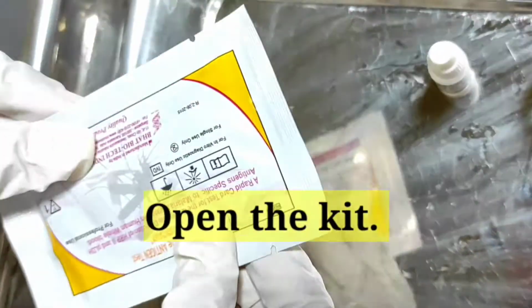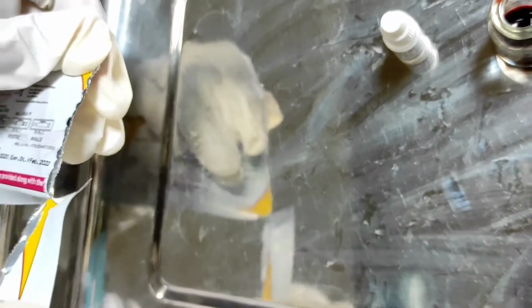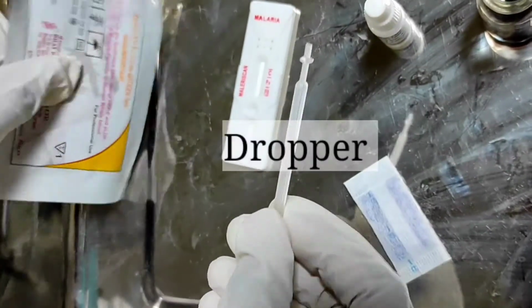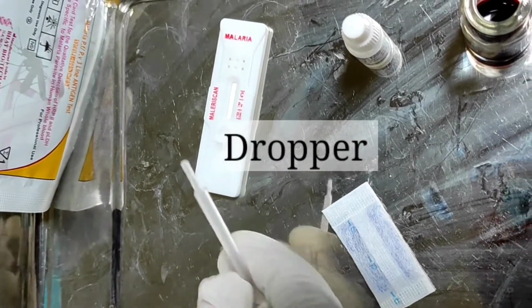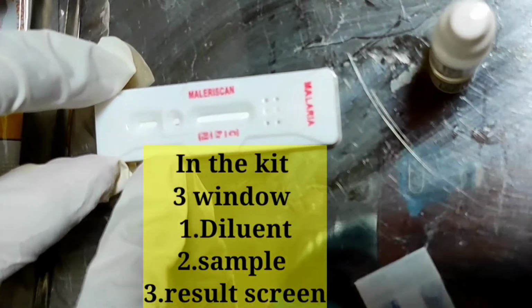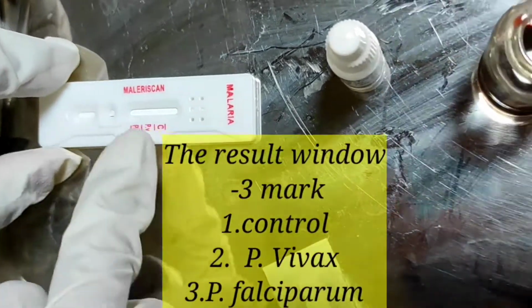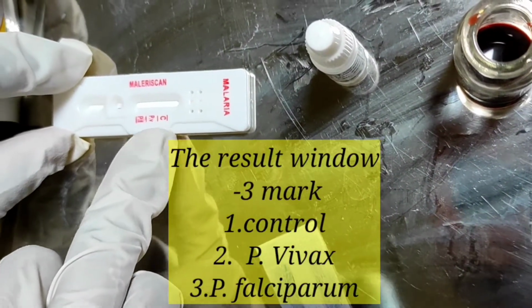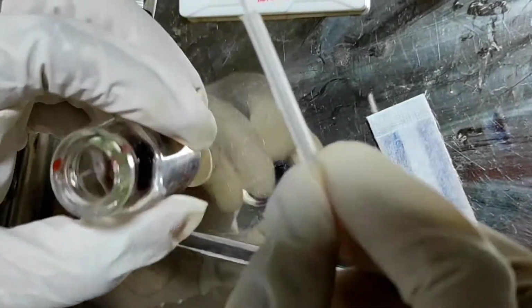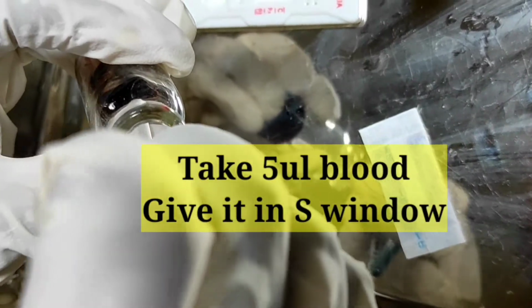Open the kit and carefully keep it on a flat surface. In the kit there is a dropper. With this dropper we have to fill the sample window with 5 microliters of blood. Take 5 microliters of blood and give it to the S window.